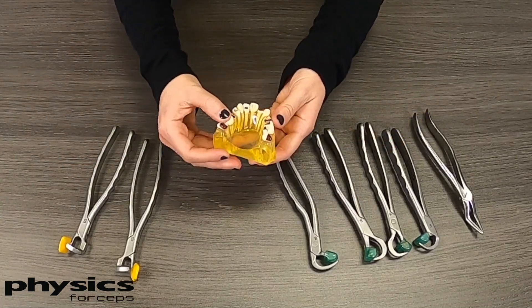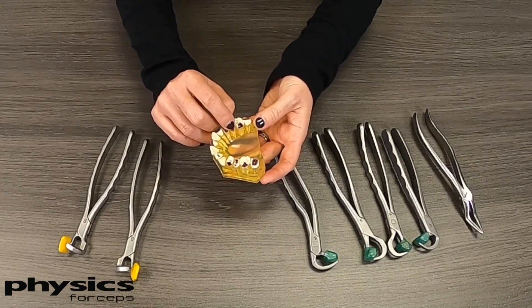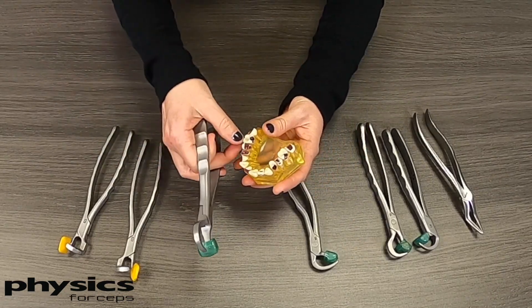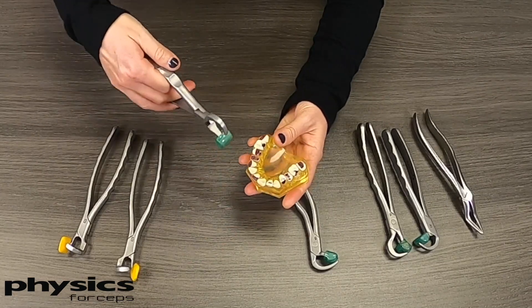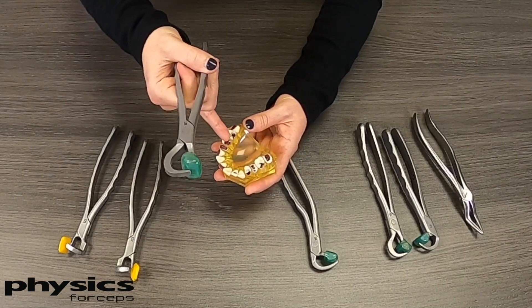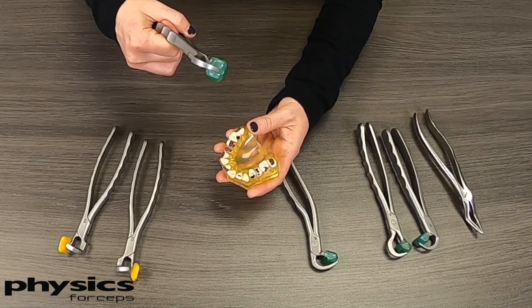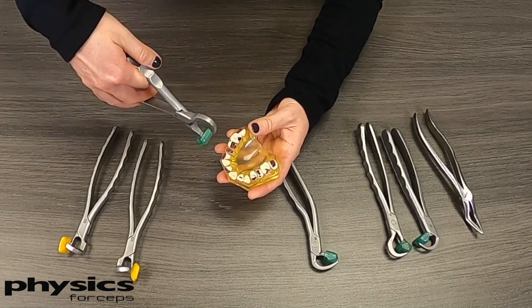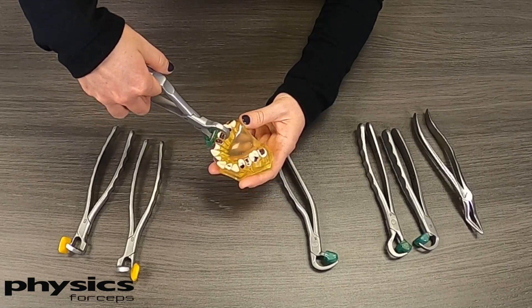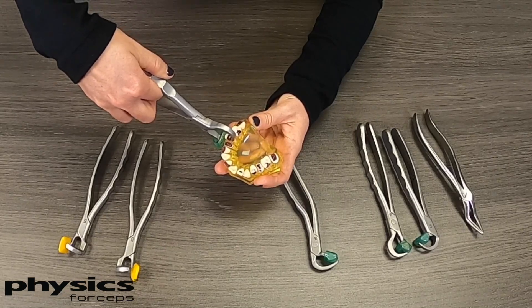One final question we get is about broken down teeth. These can be very challenging to remove, but the Physics Forceps will work just fine. You need to make sure the beak is onto solid tooth structure. If necessary, you can drill into the tooth to remove decay or tooth structure first. Then place the bumper on the buccal and the beak on the lingual, and slowly rotate the tooth towards the buccal to remove it.